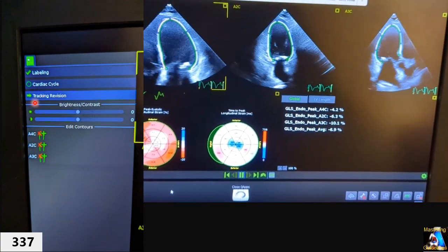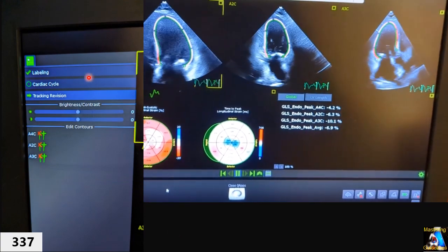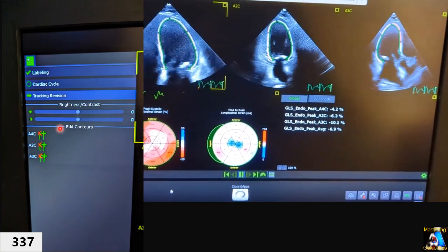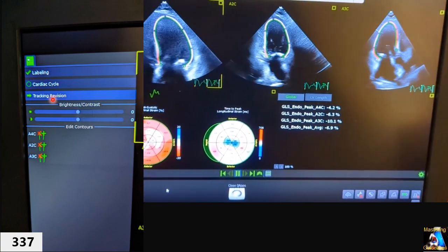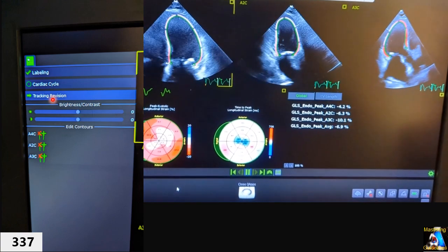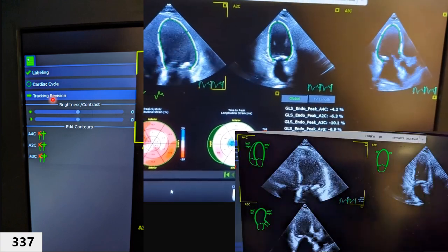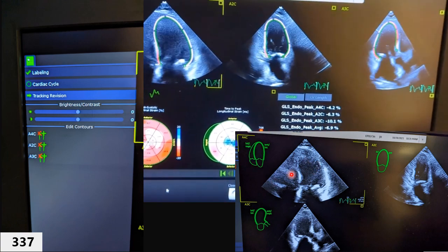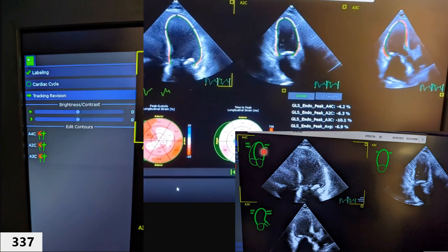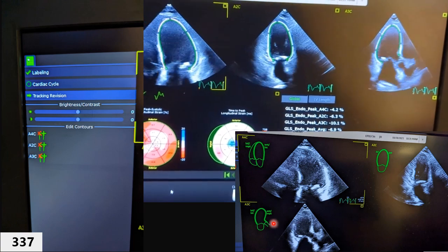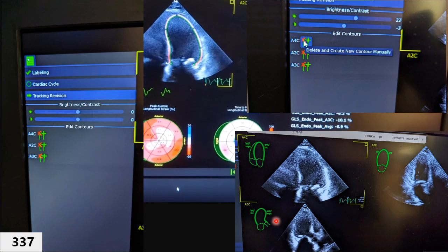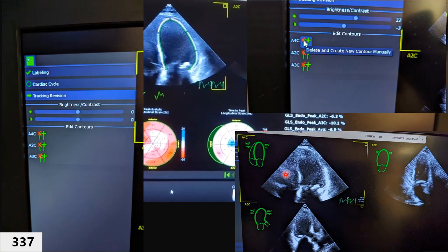On the left side of the monitor you will see several options. One option is 'Label' — use this to verify that the machine has correctly labeled each of the three views with their body markers: apical four-chamber, two-chamber, and three-chamber. If the tracing is completely off, you can go into 'Edit Contours' to manually correct it.